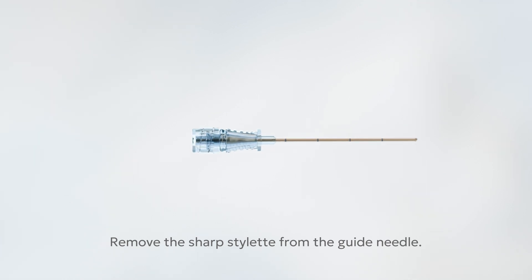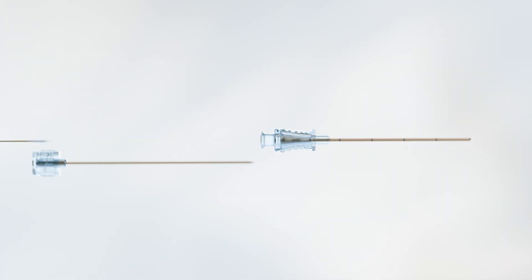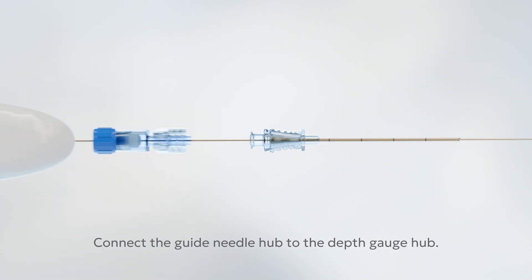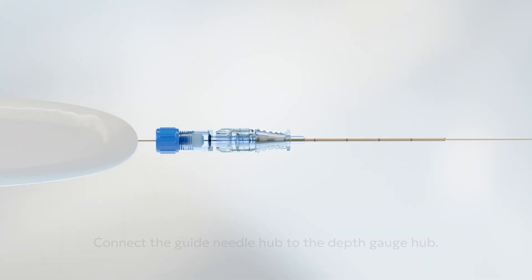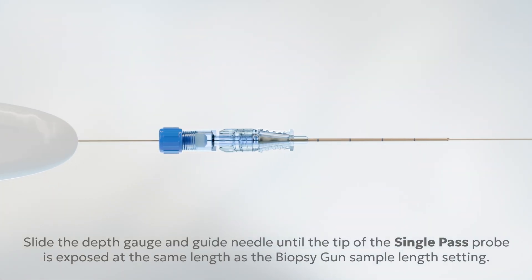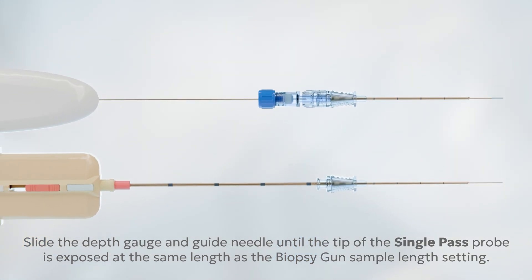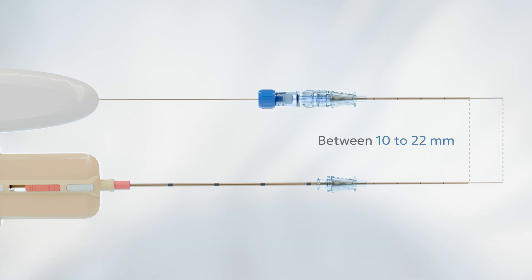First, remove the sharp stylet from the guide needle. Next, place the Single Pass probe into the guide needle. Connect the guide needle hub to the depth gauge hub. Slide the depth gauge and guide needle until the tip of the Single Pass probe is exposed at the same length as the planned biopsy gun sample length setting, usually between 10 and 22 mm.